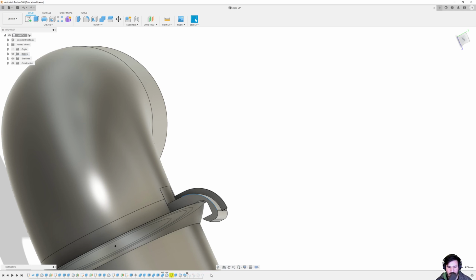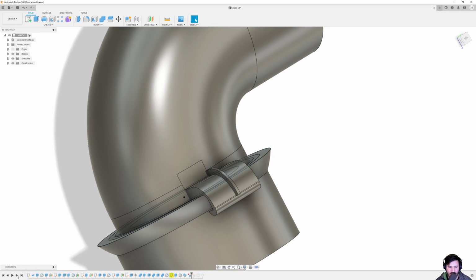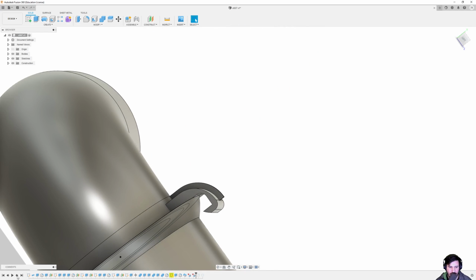You can see these next two are me deleting, I think, those two squares. Yeah, so you can see these two squares. I tried to delete them. And then I put another fillet in. Let's see where that is. Right there, just to make that a little bit nicer looking.